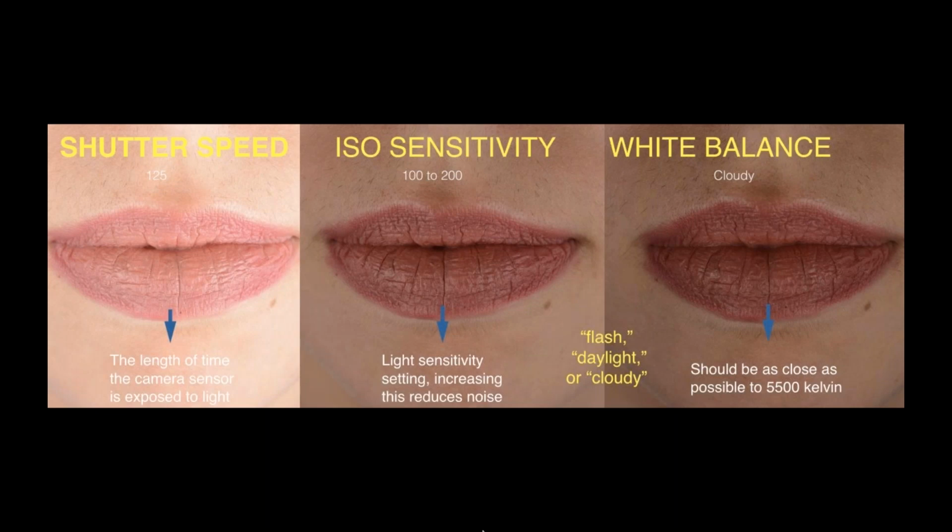I'm not using house lights or anything fancy. I'm only using the camera and the little lights on the side of my camera to give me all the lighting that I need. So shutter speed, let's go back and review to be quick.